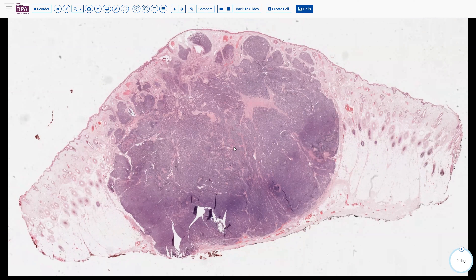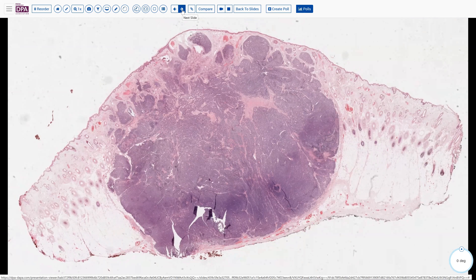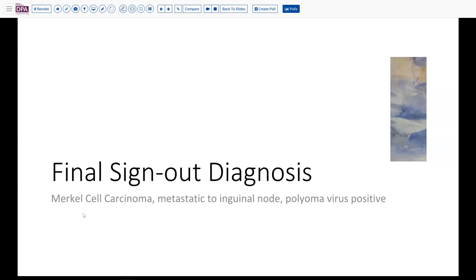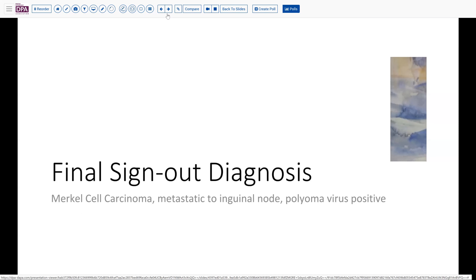And yet this is a very significant lesion to make that diagnosis. So our final sign-out diagnosis is Merkel cell carcinoma, metastatic to an inguinal node, and this is secondary to polyomavirus as the etiologic or underlying driver lesion.